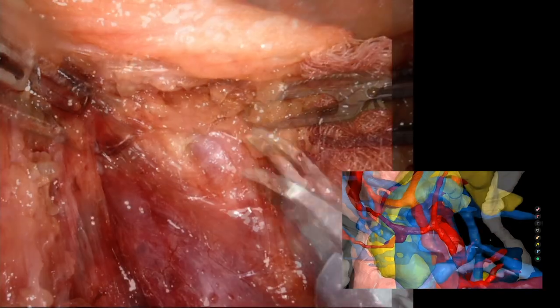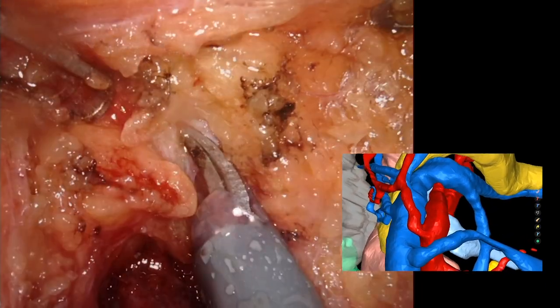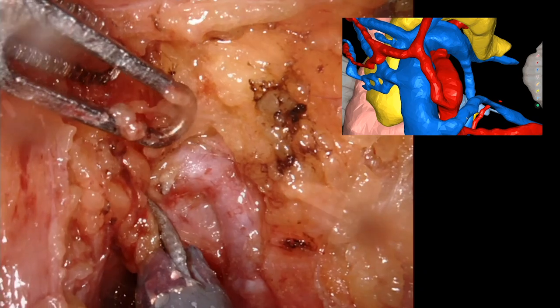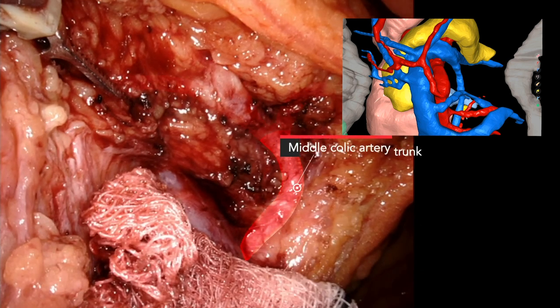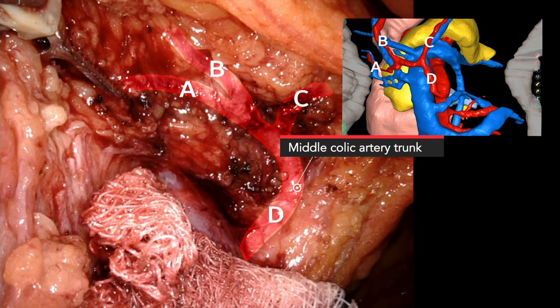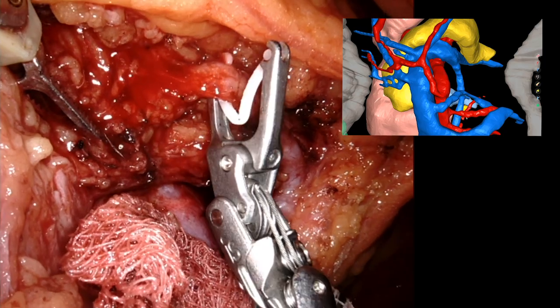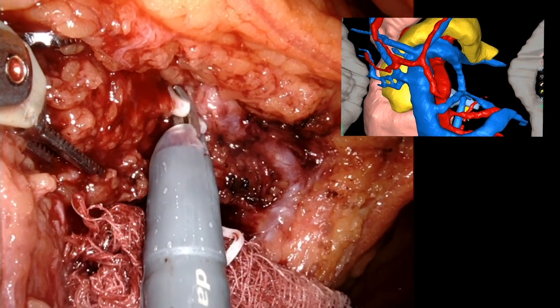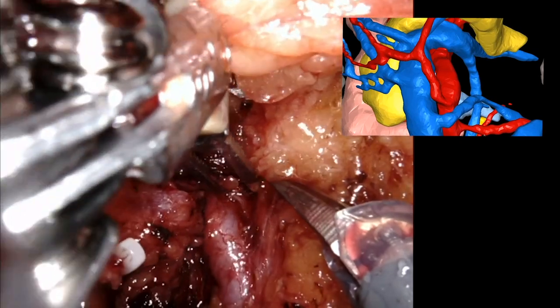For this right-sided tumour, we take the right branch and preserve the left branch of the middle colic artery. We initially misidentified the bifurcation into left and right branches, instead dissecting too laterally along the right branch at a secondary bifurcating branch point. Intraoperative analysis of the 3D model helped us recognise this and revise our clip placement.